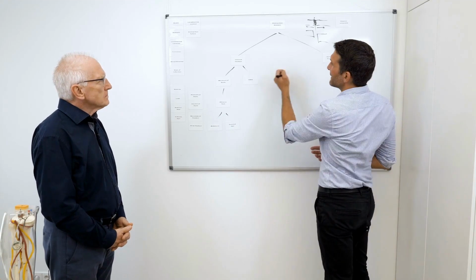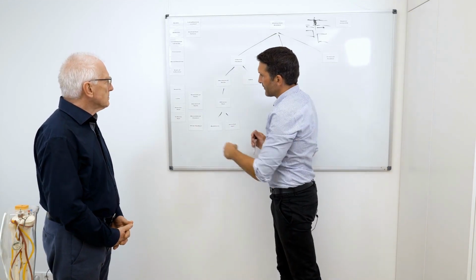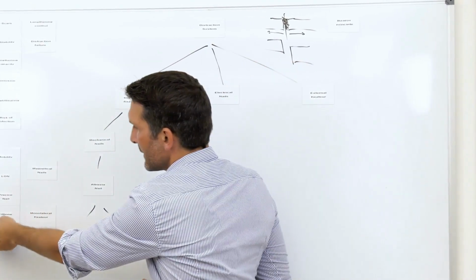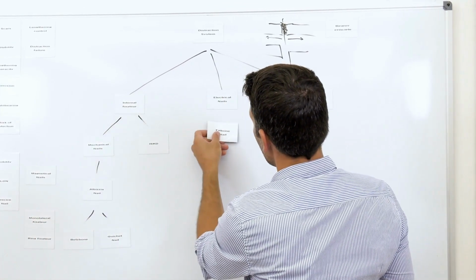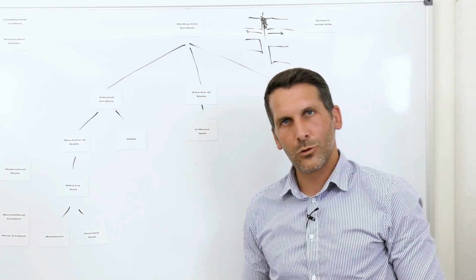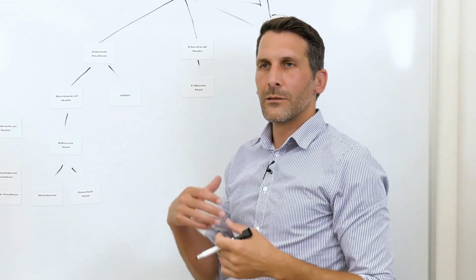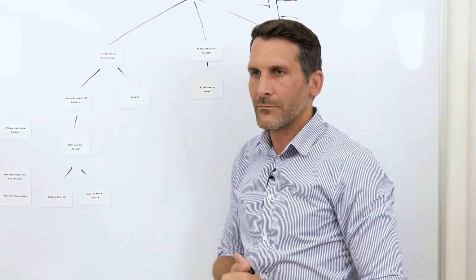The next group of internal fixators are electric nails. Electric nails are useful. Here we mainly mention the Fitbone nail. With the electric nails, it works like this. You have the nail. Inside the nail, there's a chamber where the motor is located. This motor then drives a screw spindle.